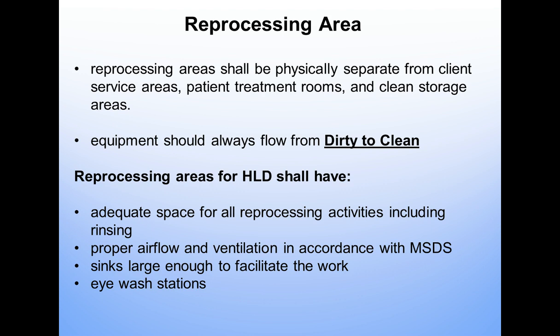However, the required standards now state that this reprocessing shall occur outside and away from the client service areas, patient treatment rooms, or clean storage areas. And your equipment should always obviously flow from dirty to clean. We know everybody doesn't have the perfect reprocessing area.